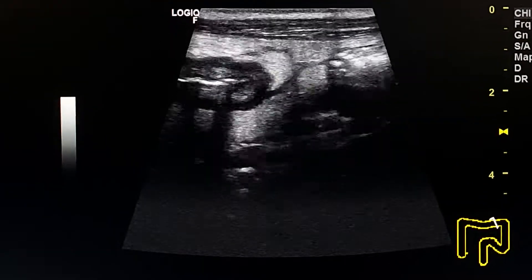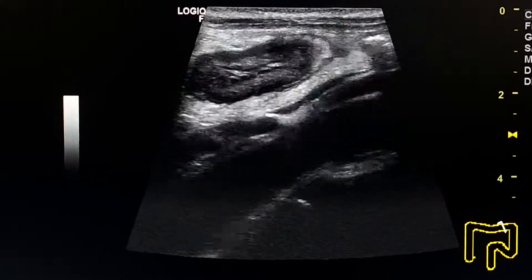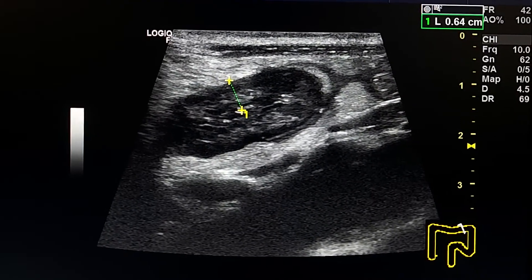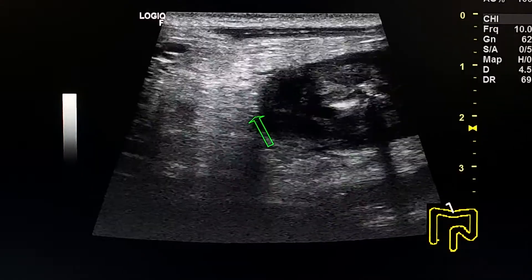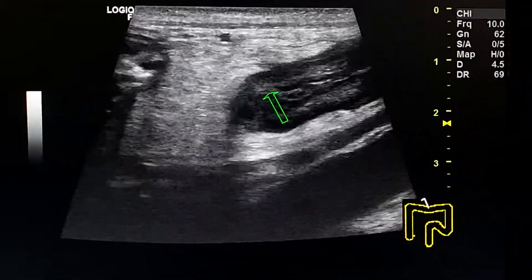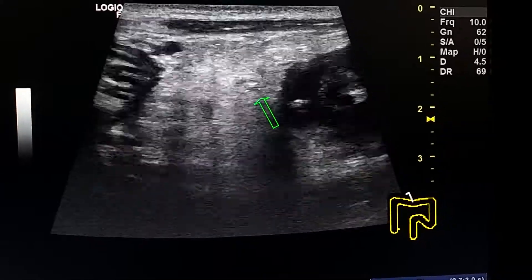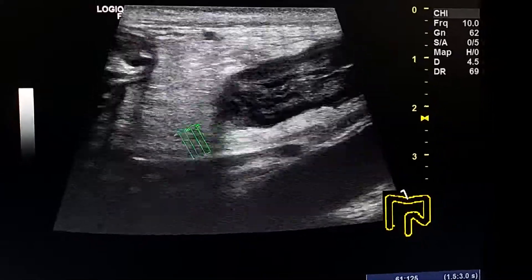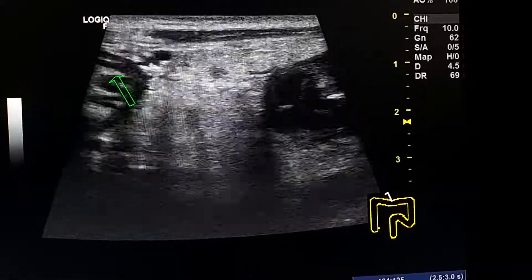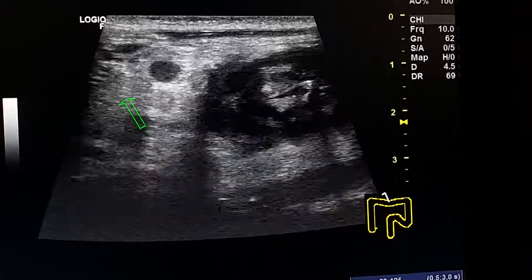This is the transverse section of the transverse colon. The thickness of the wall is 6 millimeters. This is a section at the upper border of the transverse colon. We see the mesocolon here, and this is the greater curvature of the stomach.